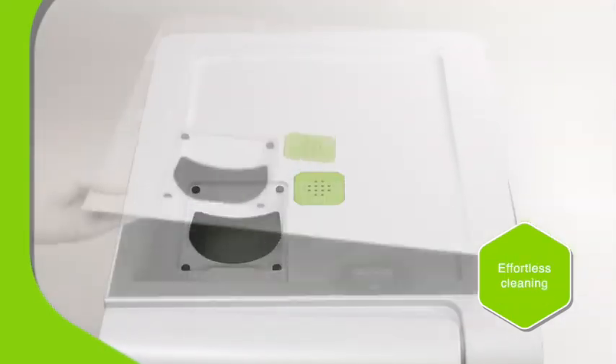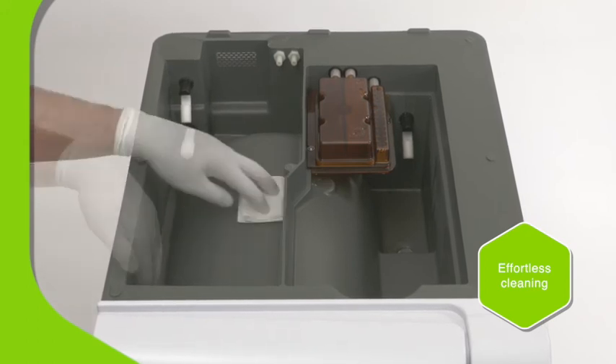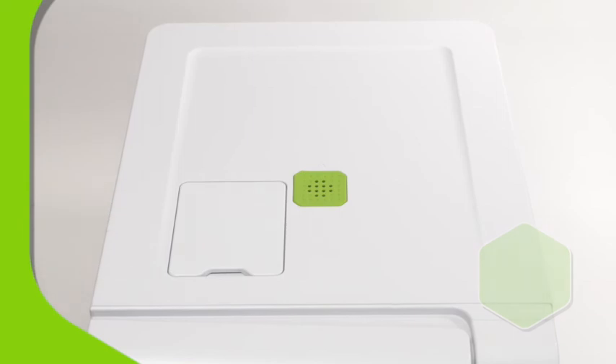The water tanks are easily accessible for cleaning without the use of tools — just another example of the high quality, user-centered design. No detail too small.